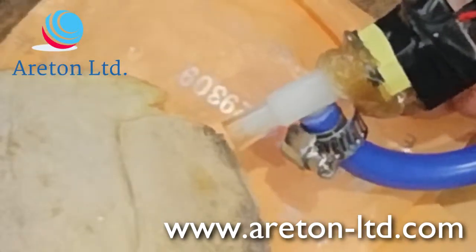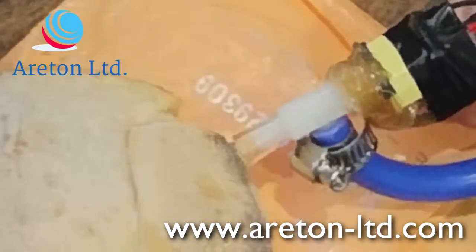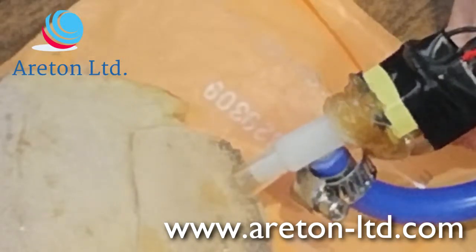Perfecto, se ve. So now I've got my model here. I've got the device there. The device, have a look, it should be set up. Let me try it.